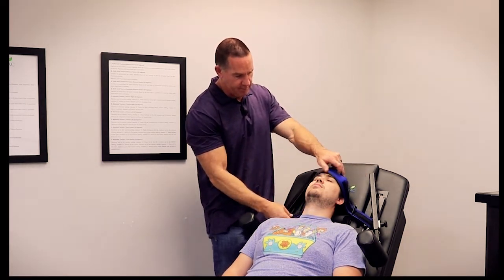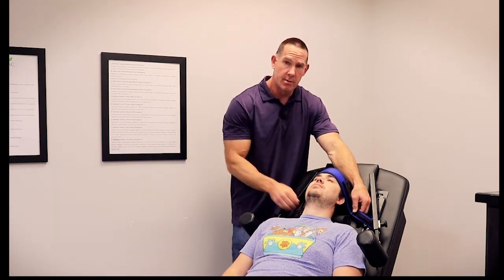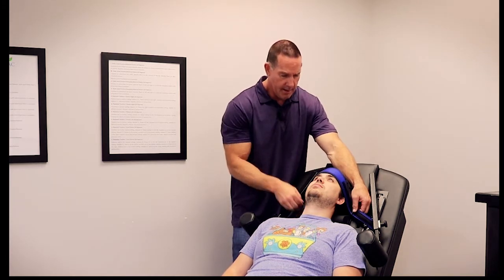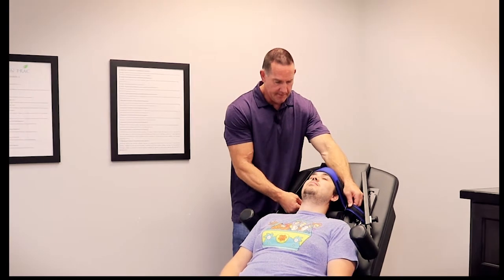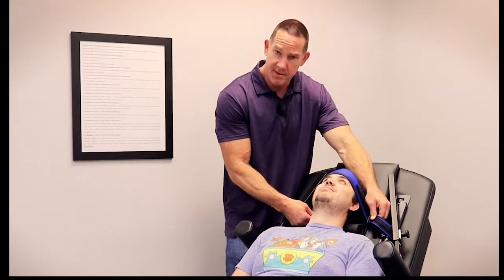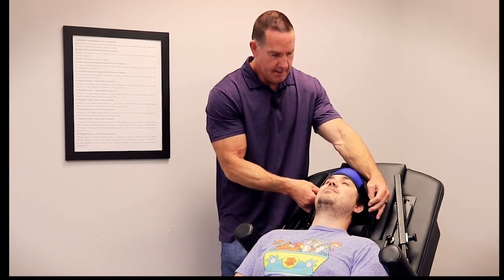Then we'll put the strap over his head. I grab down low on both sides and pull at the same time. The way this is tensioned correctly is it's like you had a Botox injection — you'll get a little stretch of the forehead. That's all you need. You don't need to pull this thing super tight; it just needs to be snug so it doesn't slip. Then we fasten that.